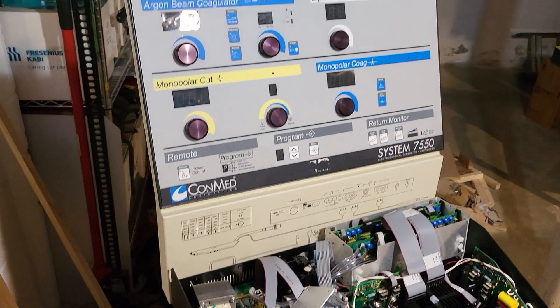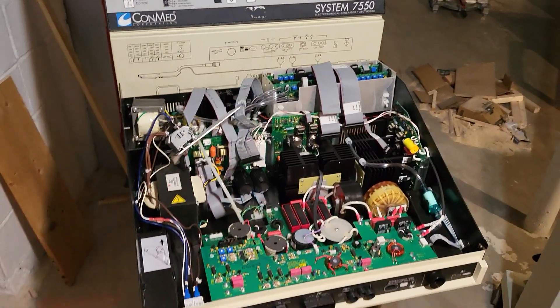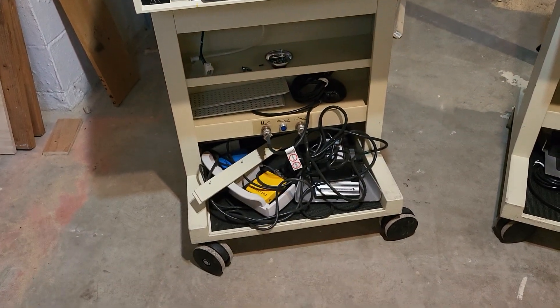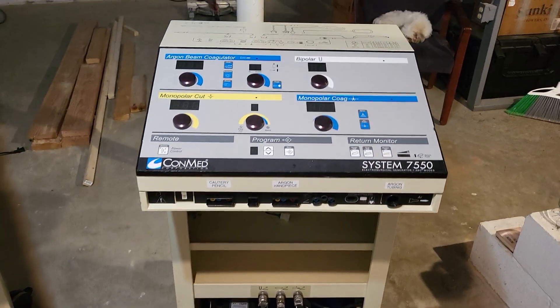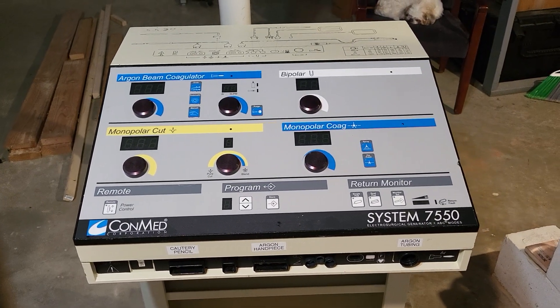So this is the concept. I wanted to make a beginning video so everybody can kind of see where it starts, and then we will see where it finishes. Again, this is the ConMed System 7550, argon beam coagulator, that we're turning into a training unit.